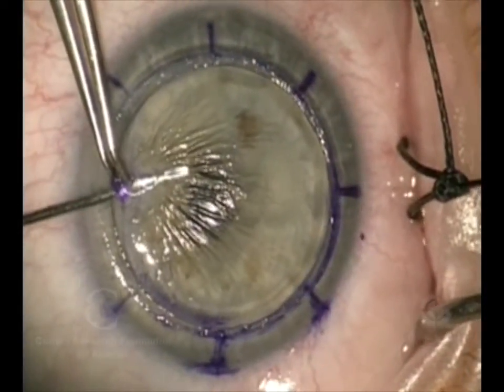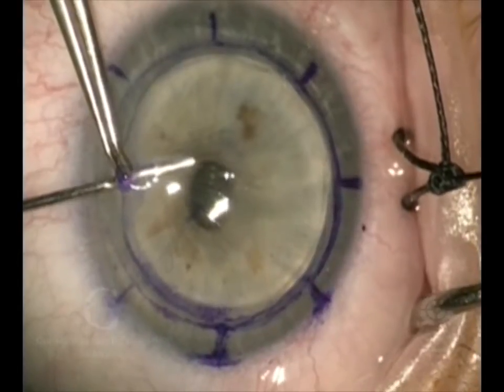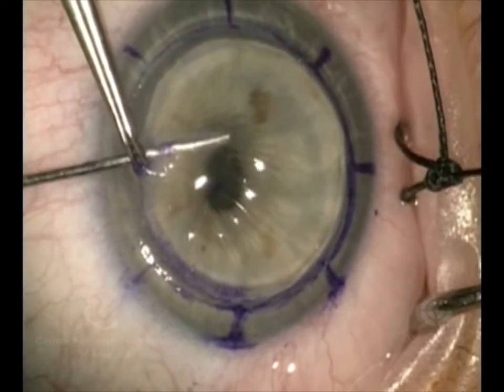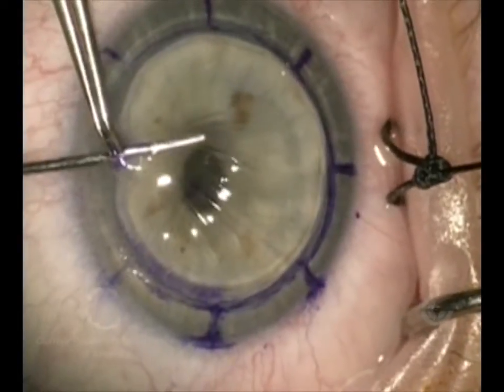We've started a small tunnel into the cornea that we're going to remove with a small needle. This is a blunt needle that we're pushing in a little bit farther. The whole purpose of this is to get into the tissue of the cornea — the stroma.